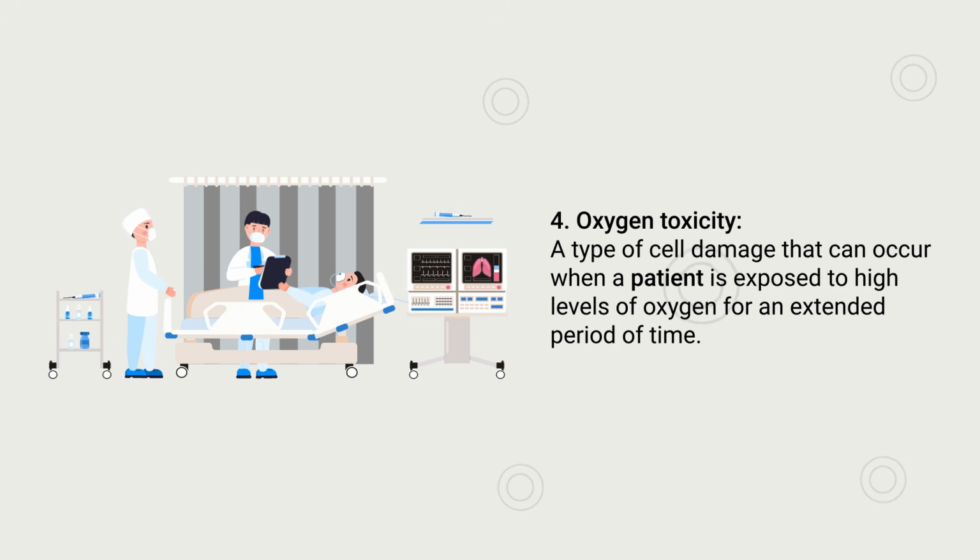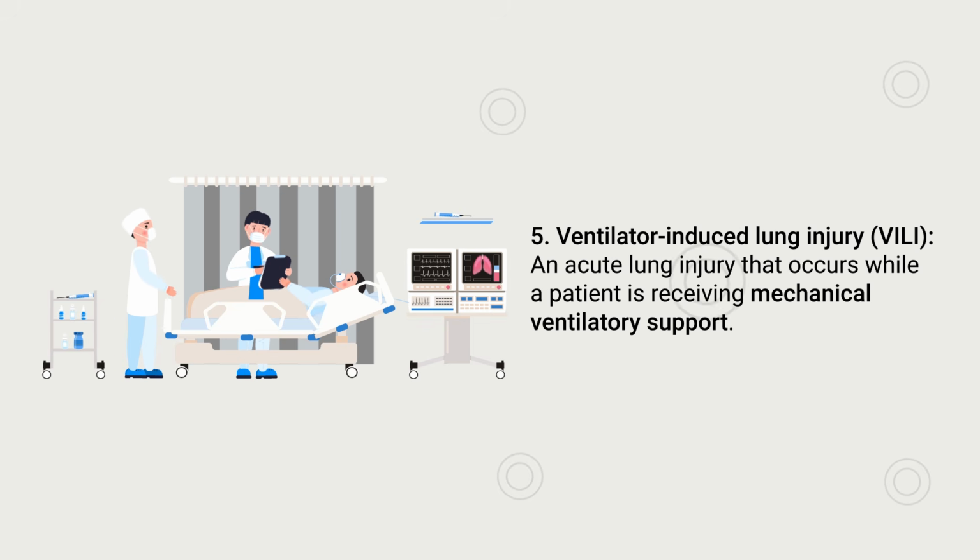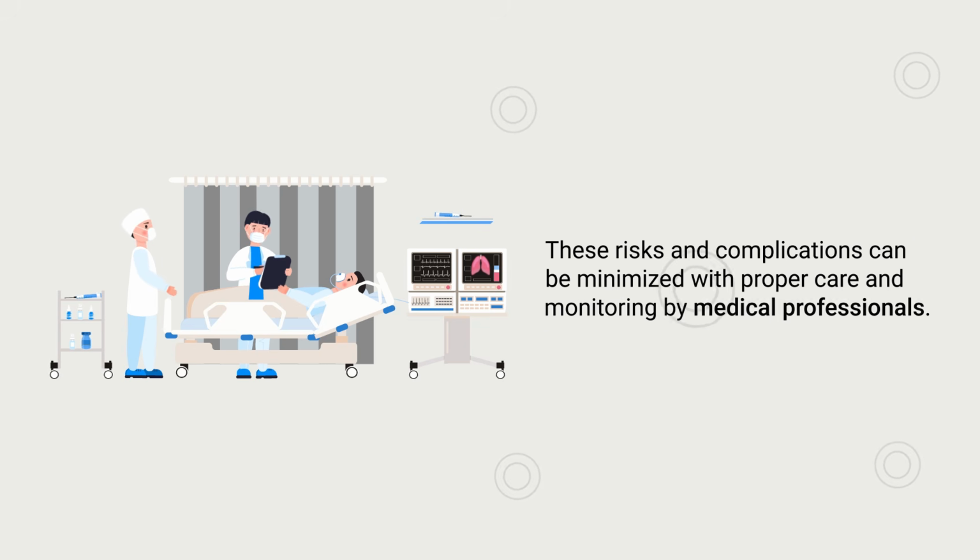Oxygen toxicity, which is a type of cell damage that can occur when a patient is exposed to high levels of oxygen for an extended period of time. And ventilator-induced lung injury, which is an acute lung injury that occurs while a patient is receiving mechanical ventilatory support. With that said, these risks and complications can be minimized with proper care and monitoring by medical professionals.